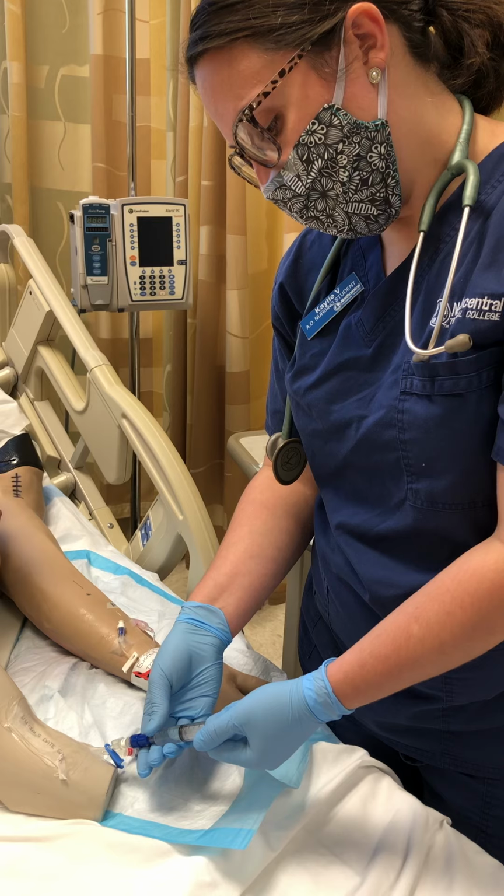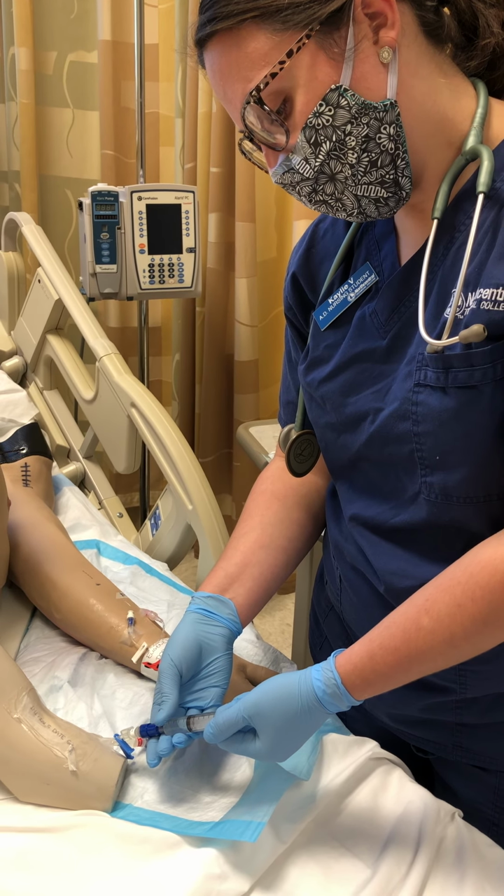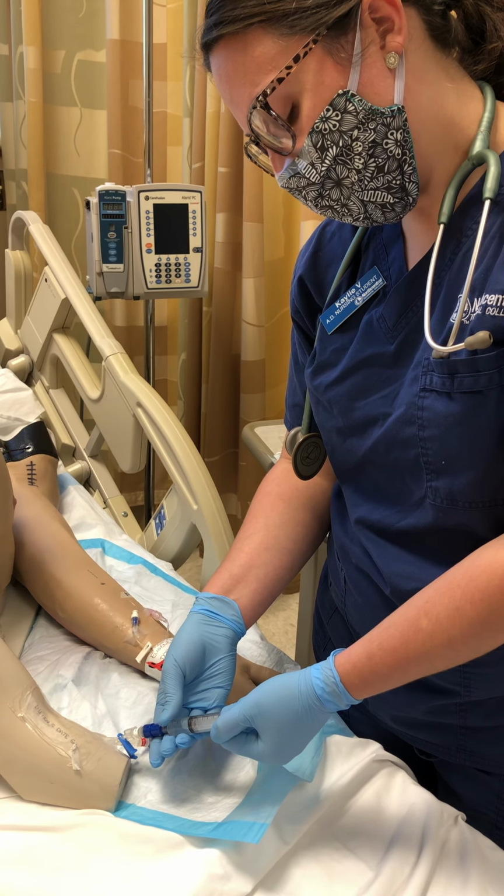All right, that was 1 minute. Now I'm going to pulsate the remaining 5.